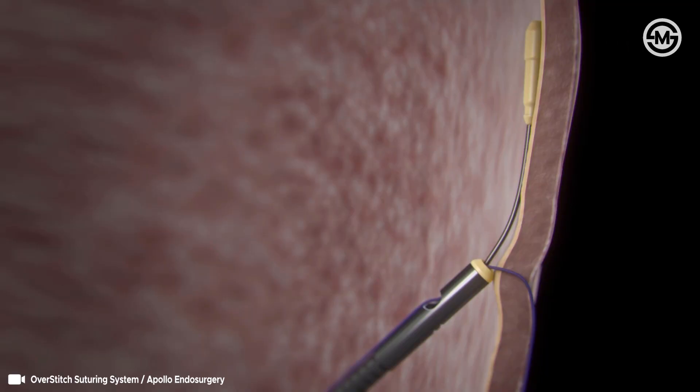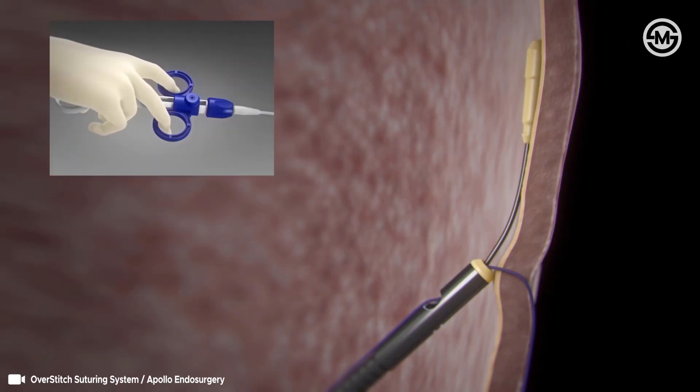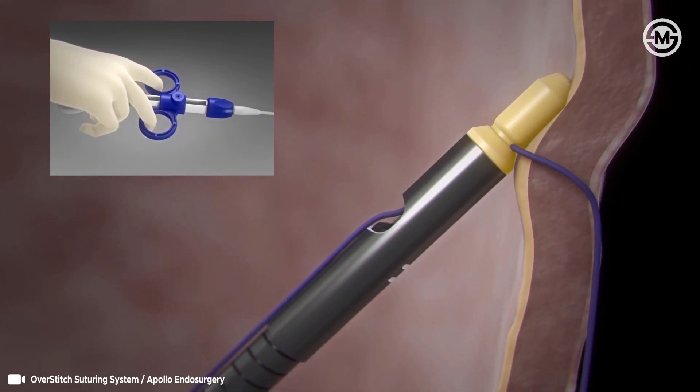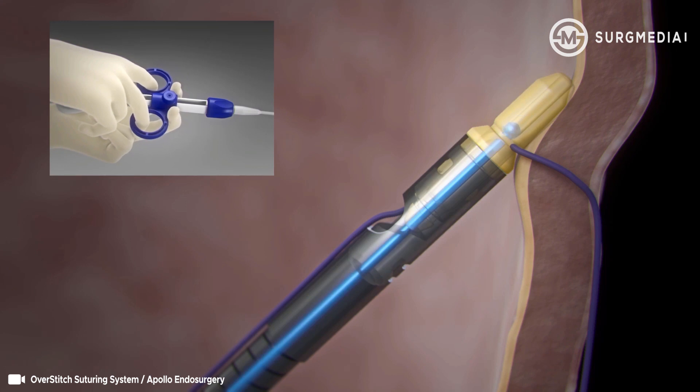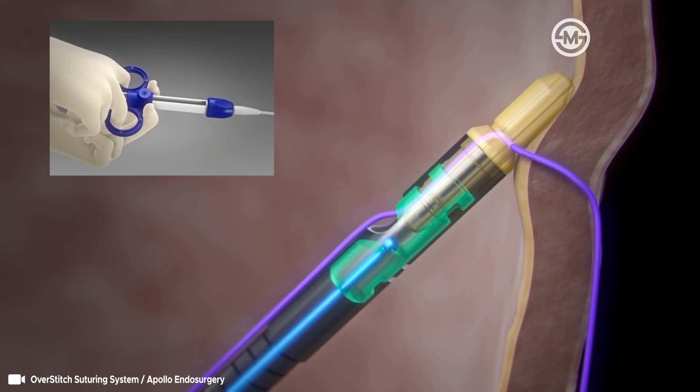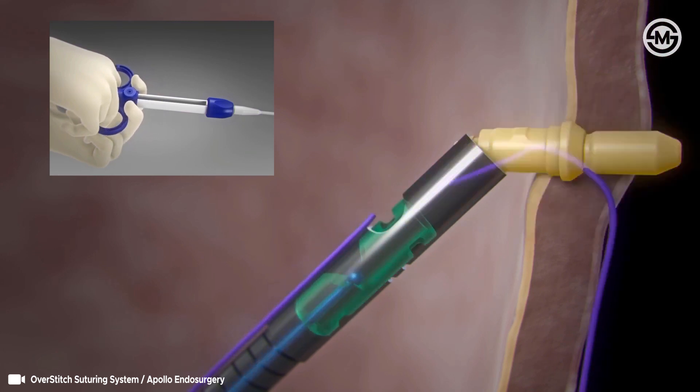Deploying the cinch is completed in three stages. Stage 1: Squeeze the cinch handle with one hand to pull the peak plug into the collar and lock the suture. Stage 2 of deploying the cinch will require two hands. Continue to squeeze the cinch handle to advance the beaded rod through the peak plug. Finally, continue to squeeze the handle to activate the suture cutter and release the peak collar and plug.